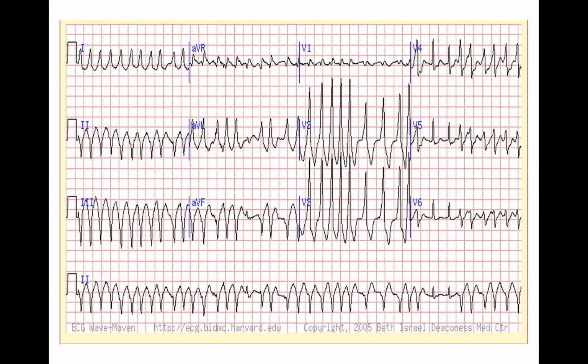Either they go through the accessory pathway or through the AV node. They will go through whichever one is not still in the refractory phase. What is engaged with an action potential will be blocked. So in between, you may find some P waves. They find their way down the road, get conducted normally, and give you this capture beat.